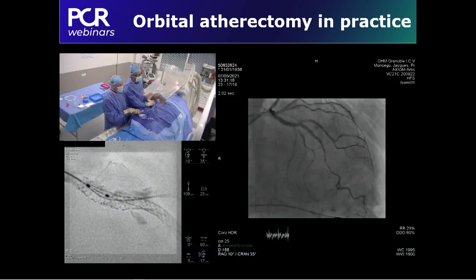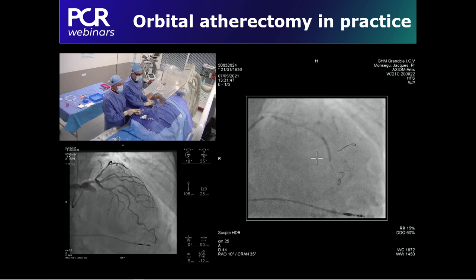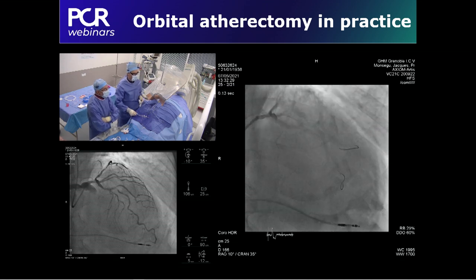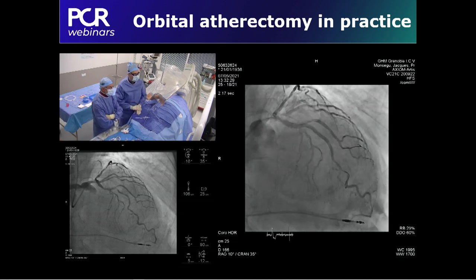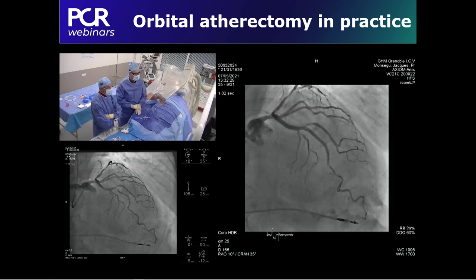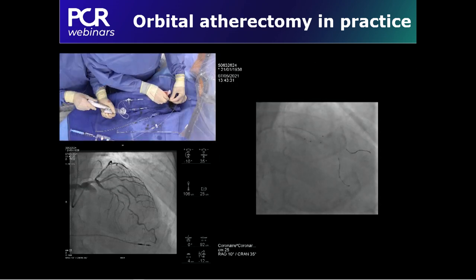Okay, seems to be good. Okay. Yeah. Off. Yes. So the LAD is very nice. Just a question about the diagonal. Okay, go ahead. That's good.